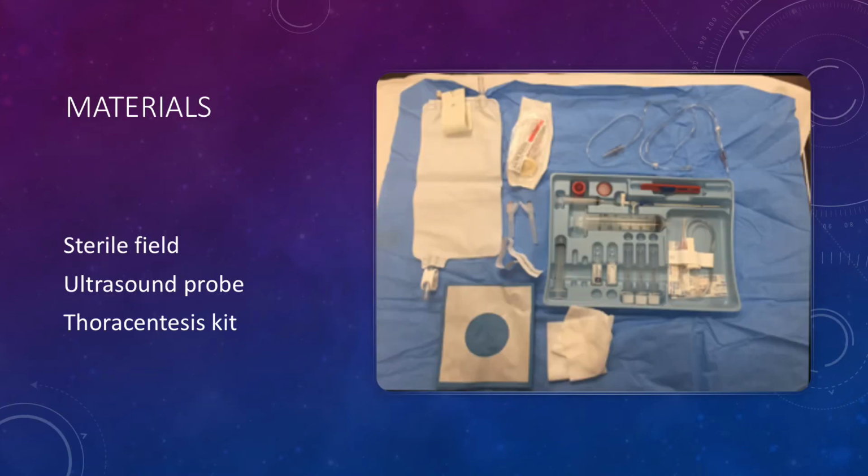You will need a thoracentesis kit, as well as a sterile probe for the ultrasound and a sterile field. This is an example of what one of the kits looks like.